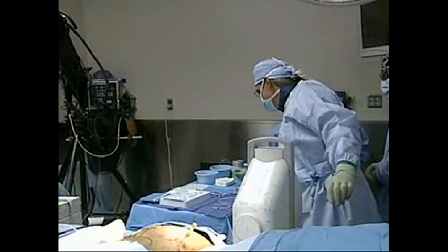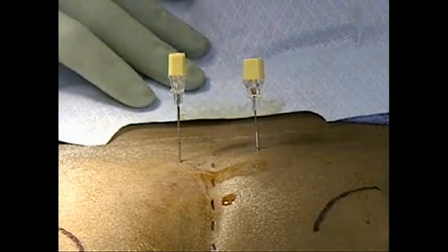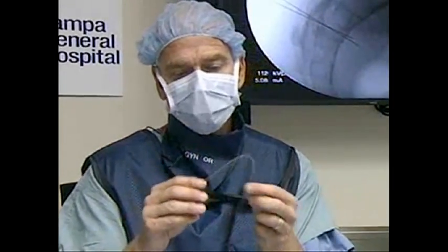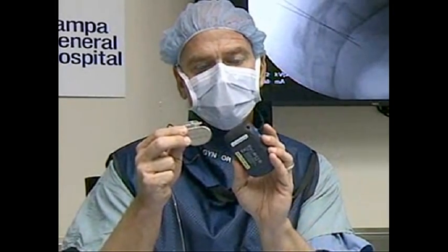Once you've had the test implant done, you'll have this external box and you're able to change the stimulation to see what kind of best response you get. You'll keep a log book to document how much you're voiding, when you're voiding, and then come back to the urologist who will look at the log book and determine if you're a candidate. Once determined a candidate, they'll put in the permanent lead, which will be below the skin, connected to an implantable pulse generator. This device has a remote control so you can adjust it up and down, and there are several programs so your urologist can change the settings on the implant to get you the best results.